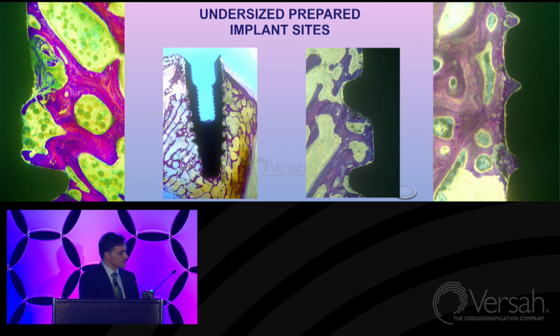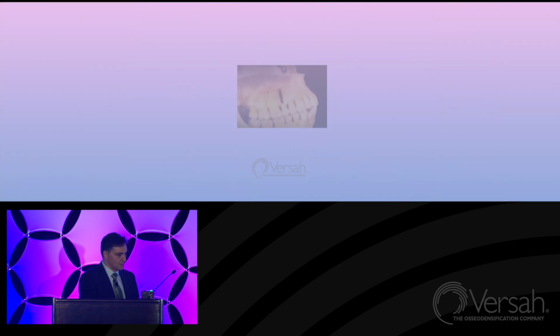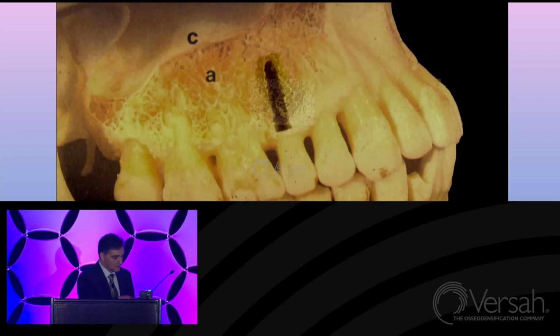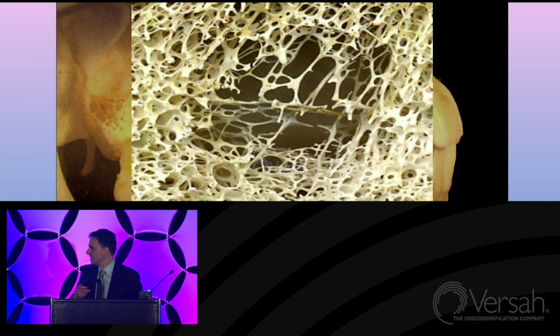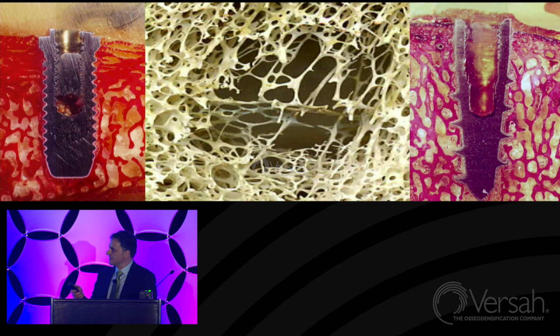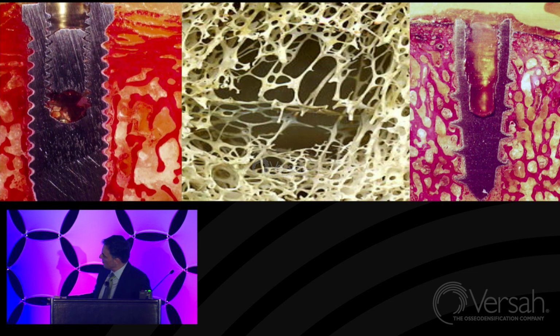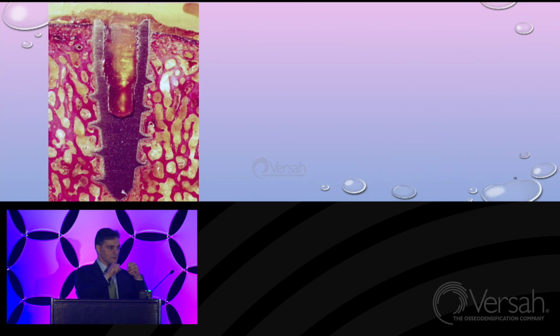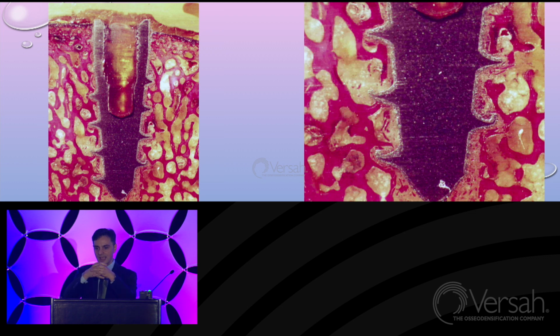And this is what can happen in the maxilla, as you can see here, where the bone is like this. If we place an implant in this bone with undersizing the preparation, and this is a histological preparation immediately after placement, we can find a lot of bone fragments at the interface and bone dust. This bone dust must be resorbed, remodeled, taken out by the osteoclasts, and replaced by new bone from the osteoblasts. And it takes time.